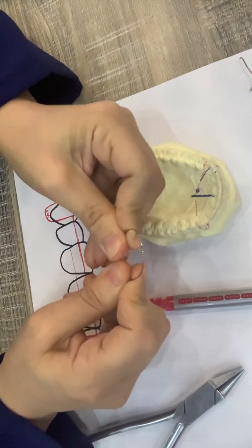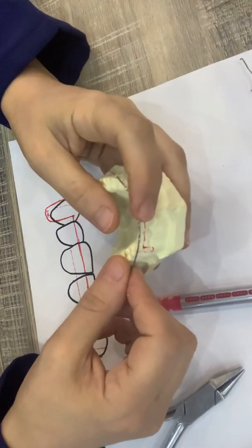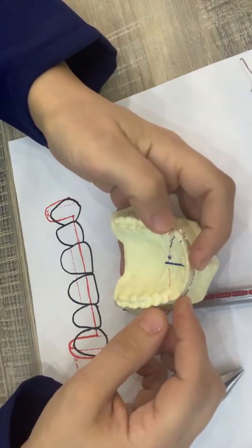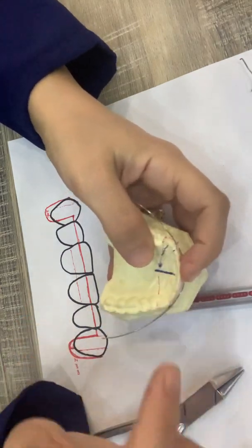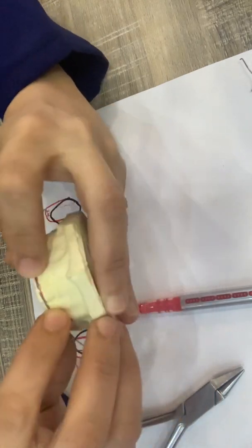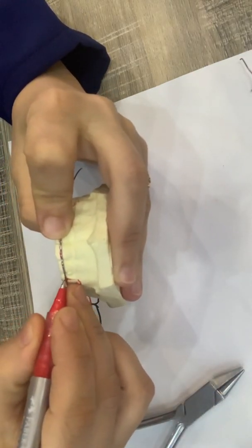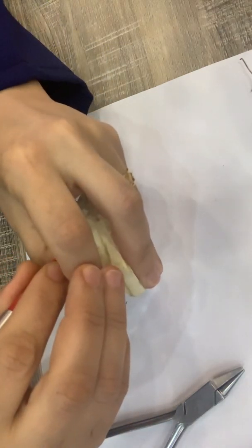Smooth curve is made this way. The curve should slightly touch the upper 6 anterior teeth, so the wire touches the 6 anterior teeth from canine to canine. Okay, then we make a mark on the wire for the U-loop at this position and at this position.